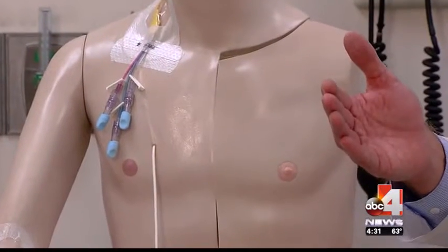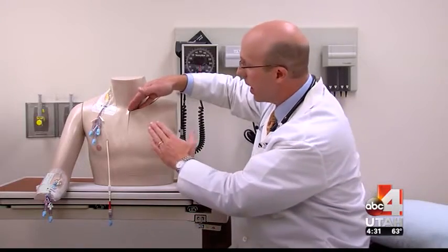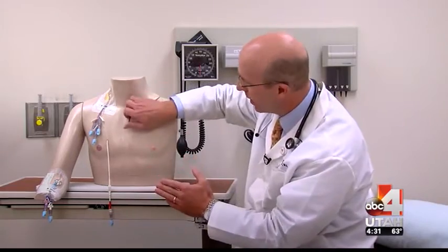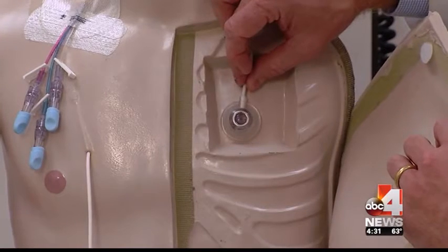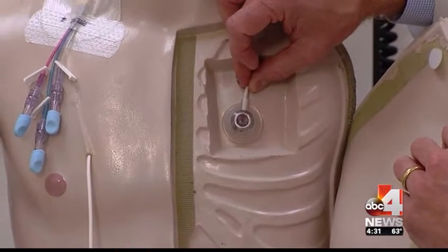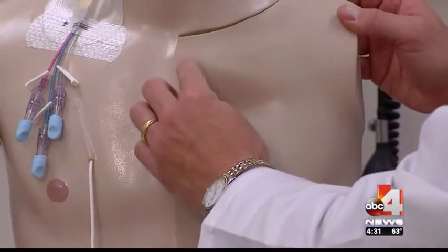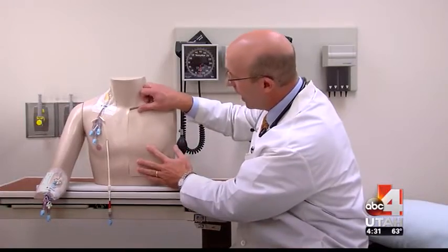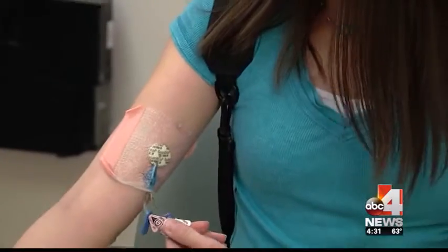The different methods are shown here on the model chest named Chester. It is actually planted underneath the skin, and if we were able to magically pull away and look underneath, it resides in the muscle of the patient's chest, and then that device can be accessed with a needle on a reliable basis going through the skin. It works for many cancer patients, but Becca had major complications from the implantable port, and she can't use a normal IV line, so doctors switched to a PICC line.